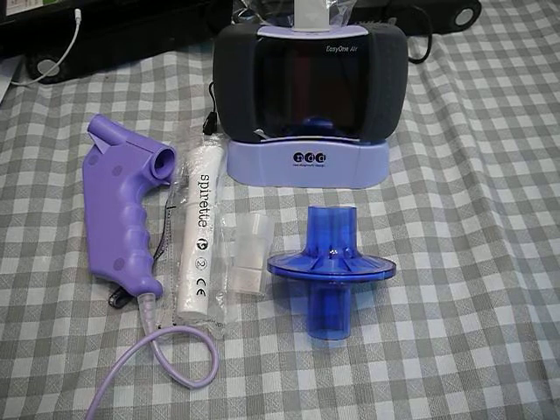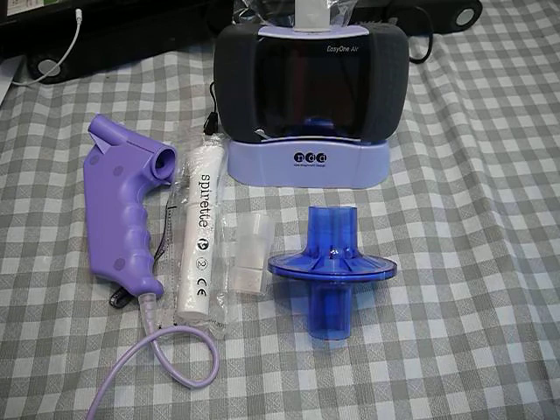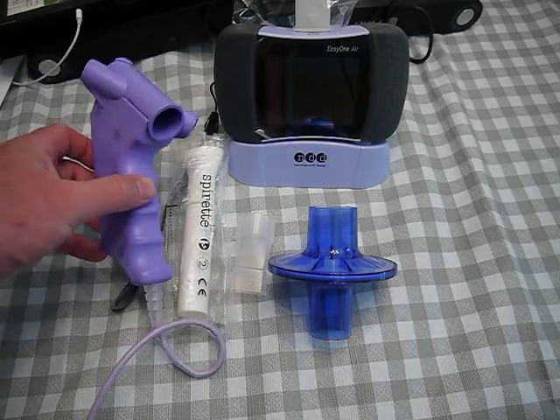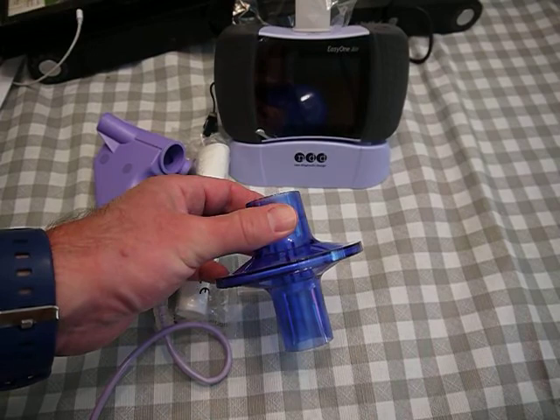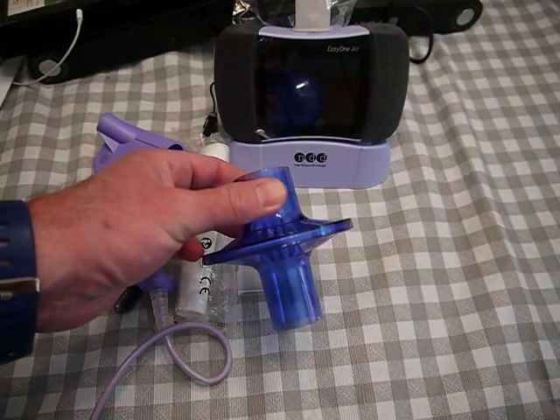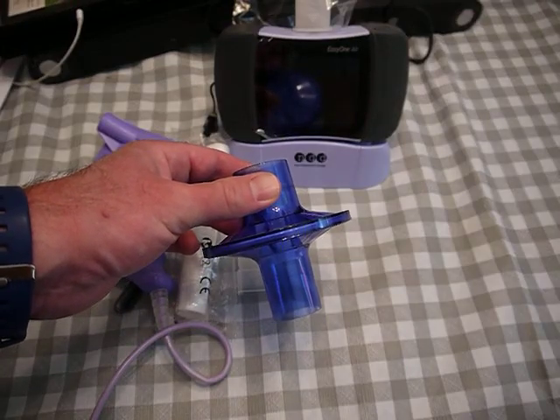Today I want to show you the inline filter solutions for two spirometers from NDD: the Easy on PC spirometer and the Easy One Air. The inline filter is designed so that it can be added to either one — you still get repeatable and accurate results, and it adds protection for operators and technicians.